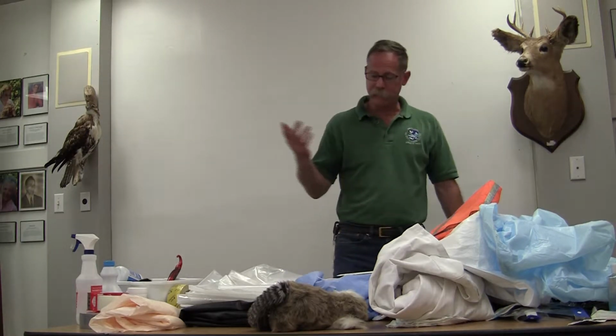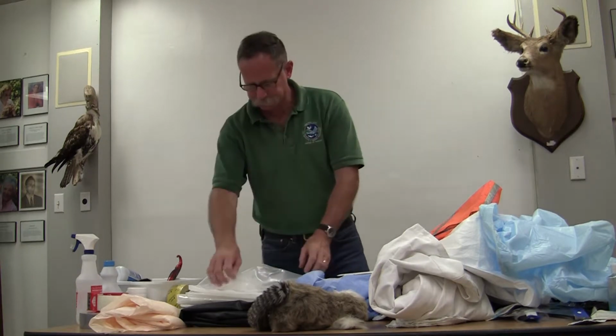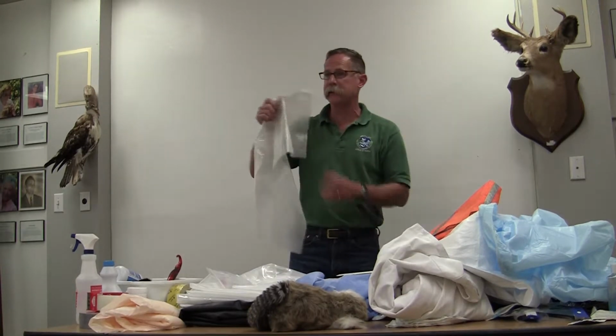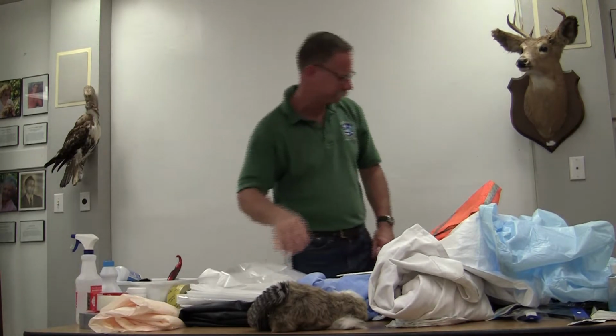We have a lot of different size bags available. This one we call our raccoon head size bag because we usually put raccoon heads in it. The bags that we use for CWD heads, for deer heads, are these 12 by 8 by 30. These are also a good size for picking up raccoons or raccoon-sized critters.